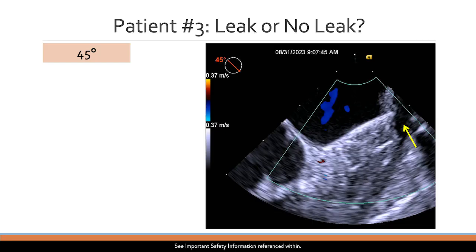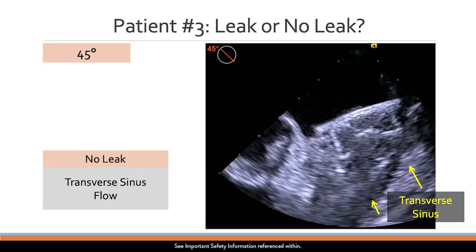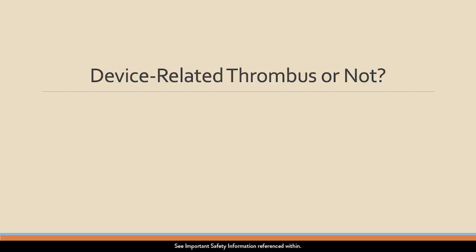How about this? Who wants to volunteer for this? Leak or not? No leak. What is it? Transverse sinus. I mean, that's important. These are all second opinions. So, device-related thrombus or not?